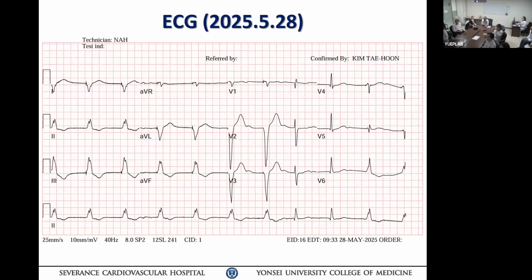So if you see a patient with a pacemaker in clinic, and you program the pacemaker, you have to have a 12-lead EKG documented, because the pacemaker programmer alone will not tell you all this information. Sometimes you believe that the pacemaker interrogation says 100% pacing. In reality, the pacemaker doesn't see the ECG, it only sees its own markers. That means it may not be capturing at all in reality. Or the pacemaker may fail to sense, things like that.